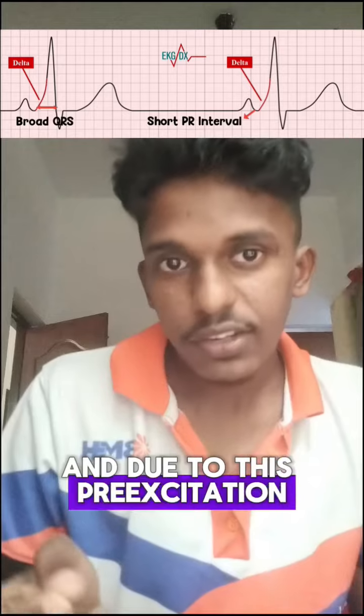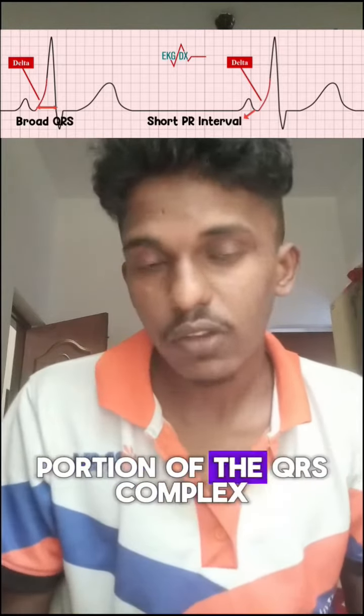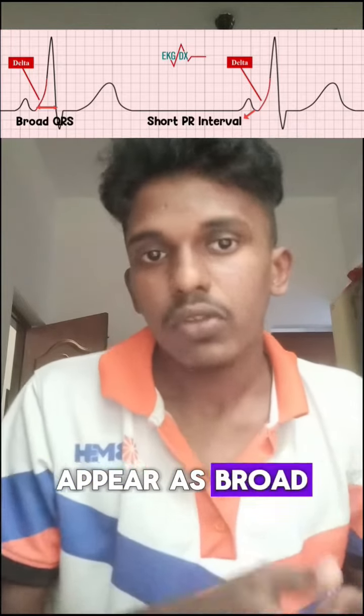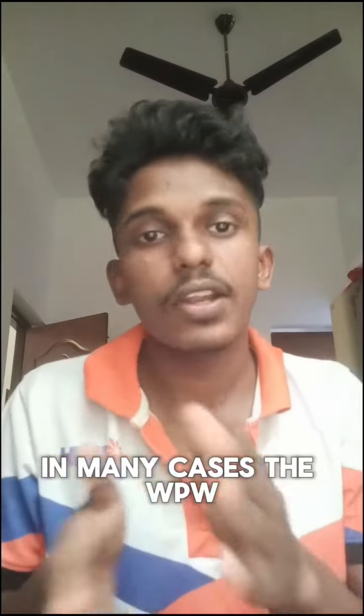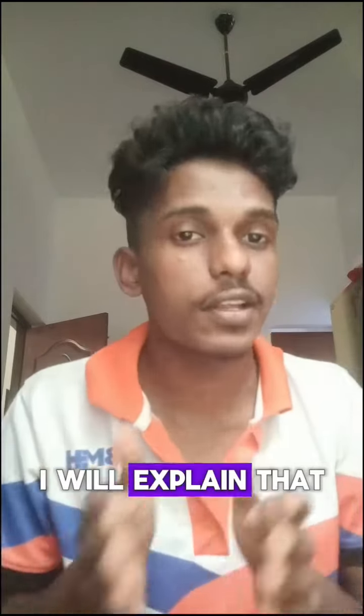And due to this pre-excitation, there will be a slurring or a slope-like appearance in the beginning portion of the QRS complex, and this is known as the delta wave. Due to the presence of the delta wave, the QRS will appear as broad. So other than these findings, you can also expect some ST and T wave changes. In many cases, the WPW syndrome will present as a pseudo-infarction pattern. I will explain that in a later video.